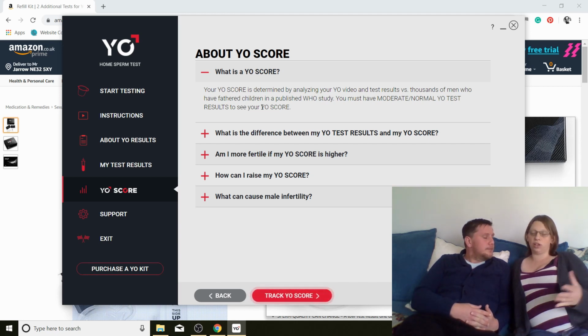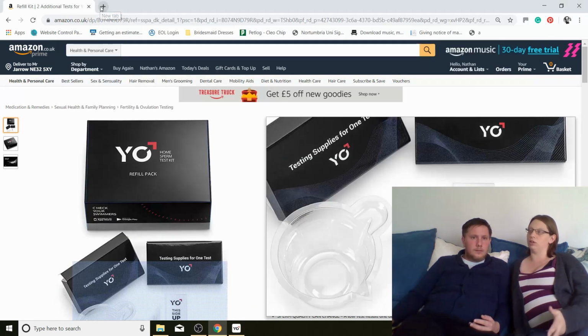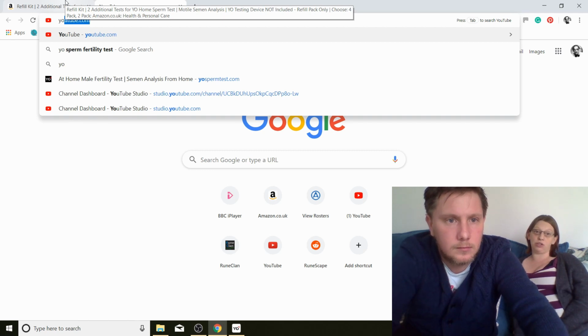And then obviously once you go to your GP, they'll send you for a full sperm analysis and you can get more information. So it won't just look at what this looks at, which is your motile sperm count. It will look at your normal forms, which obviously, as we've mentioned before, is something Nathan has issues with.